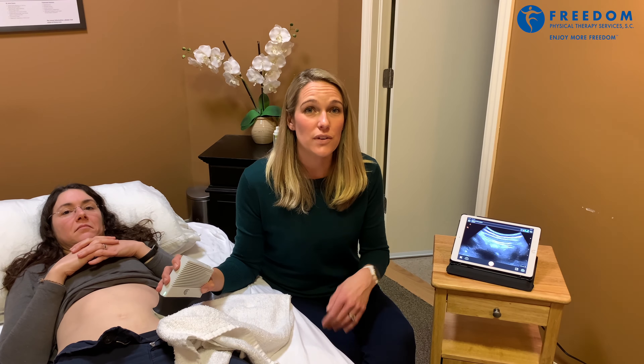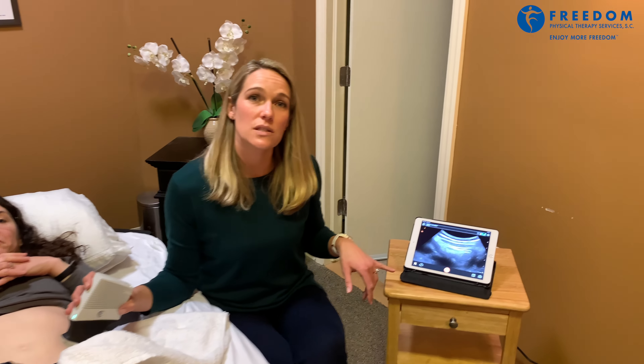We can see on real-time ultrasound if our patients are using the transverse abdominus correctly or not. Any time after you've had back pain or after you've had a child, a lot of times the transverse abdominus is not working as it should be.